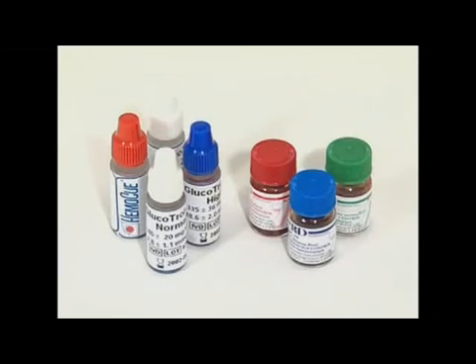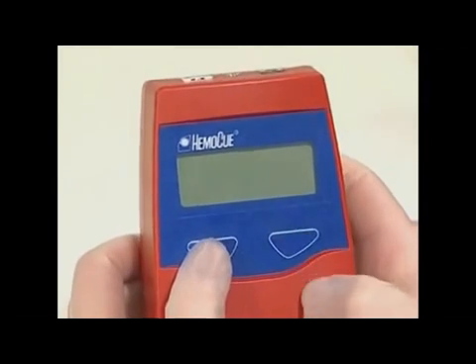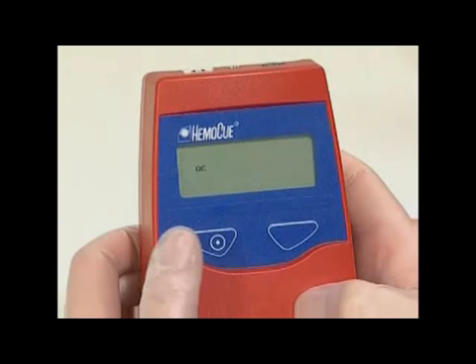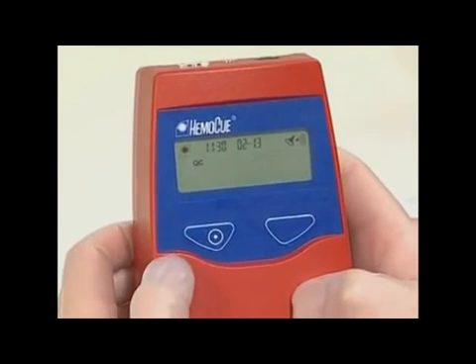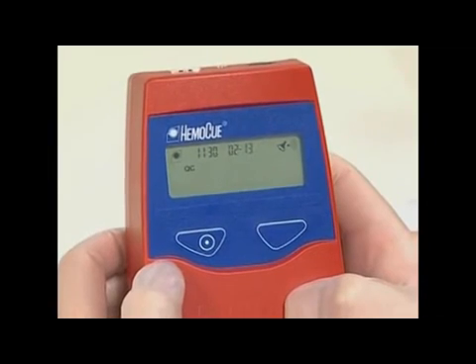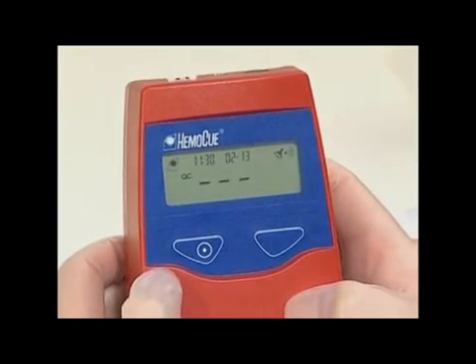By using the following procedure, it is possible to specifically identify QC results in the memory. Press both buttons at the same time — the display shows a flashing QC symbol. Select QC test by pressing the left button. The analyzer automatically returns to the measuring position and the QC symbol appears on the display.